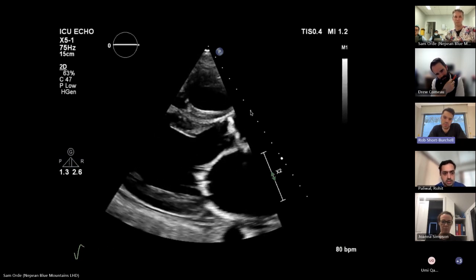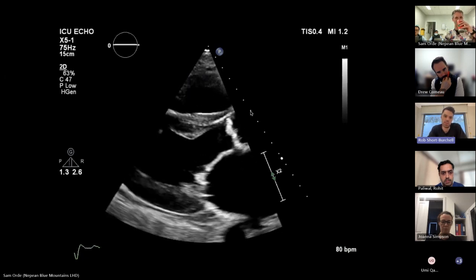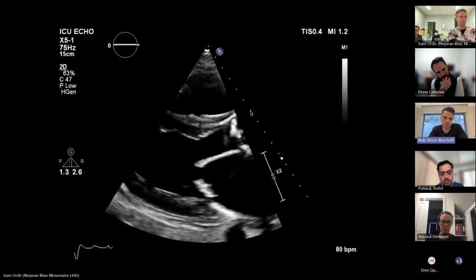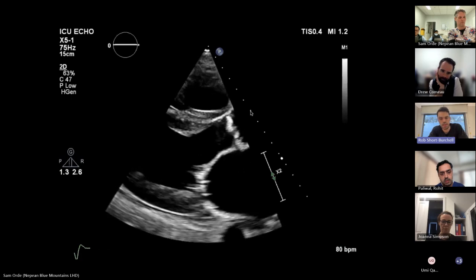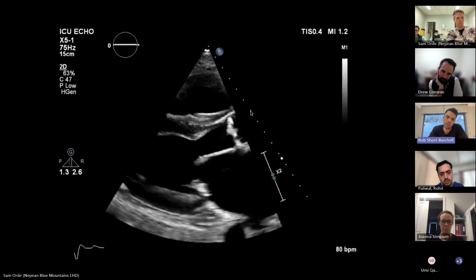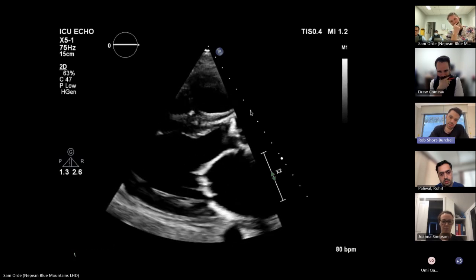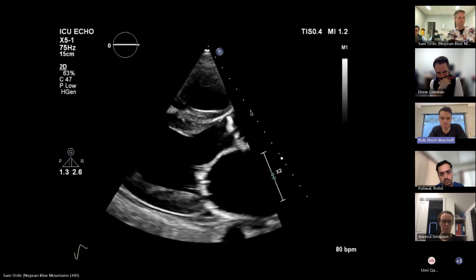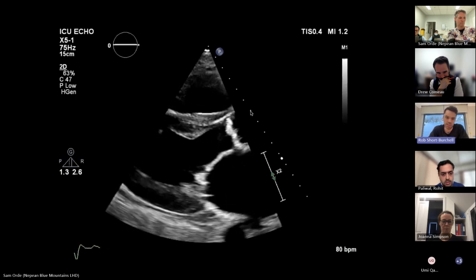So this is parasternal long axis view. I'm concerned about the LV systolic function. Both the anterior septal and inferior lateral walls appear at least hypokinetic. And in that setting, the mitral valve is not opening well. The left atrium appears dilated. The aortic valve, although this picture might be slightly overgained, appears calcified, and there appears to be reduced opening of that aortic valve. I'd like to interrogate it from other angles. The right ventricle appears normal size. I can't really comment on its function at the moment.